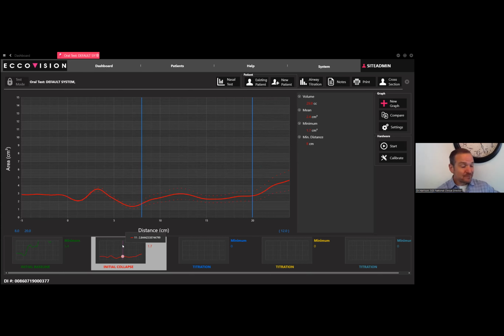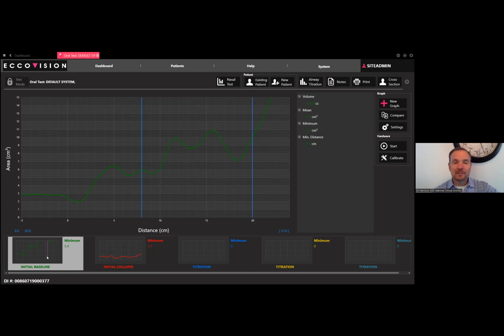Always makes me cough. And that's kind of what you want. If your patient doesn't struggle afterwards, they're protecting their airway, which is what people that have compromised airways do. So think of the patient that you just know when you see them on the schedule that you're going to need extra time because they stop you every 5 minutes. They've got to hold the suction the whole appointment. You put the x-ray sensor in the mouth and they kick it out of place. The tongue's in the way no matter where you're working in the mouth. They just really don't want you in their oral environment because it's a threatening feeling.